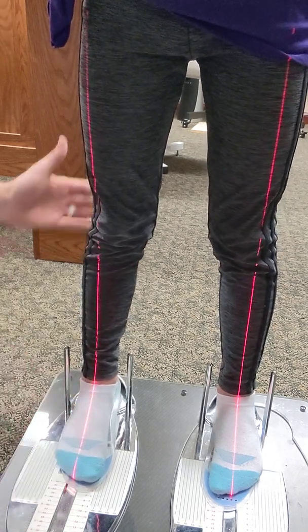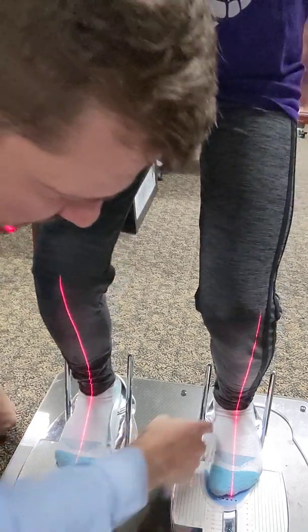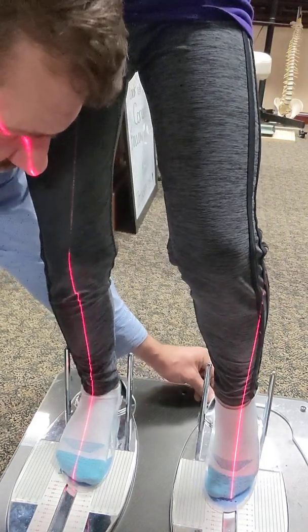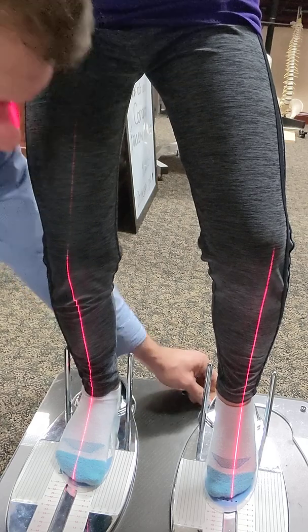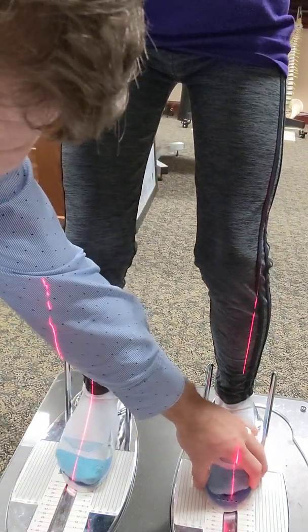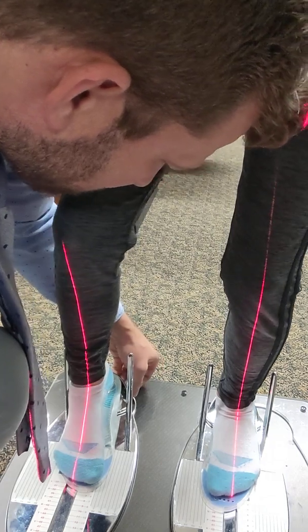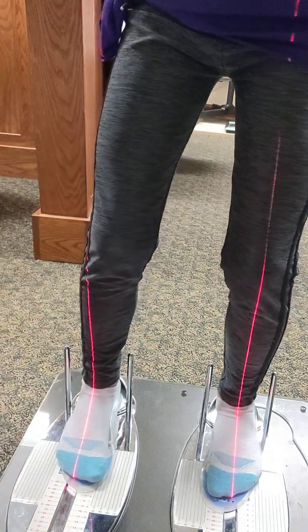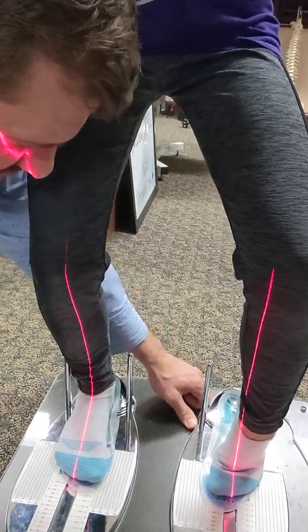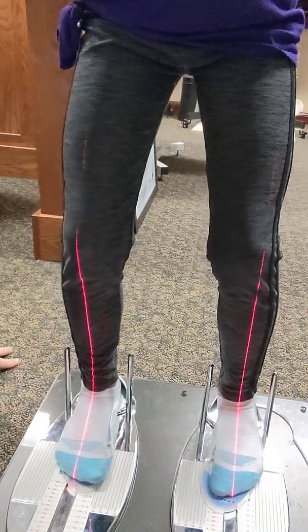I'm still wanting a little bit more for her. Go ahead and put that five-degree bend. Getting improvement — this one's still a little drop. So we're going to lift up just a little bit and add a little more support. Hop back on. Make sure that second digit is there. Lift up on your right for me, Kai — good — back down. And then getting those snow boots. I'm going to go a little bit higher here — lift up on the left — good. Let me make sure I got that one. Excellent, and then back down. That's a pretty thing.